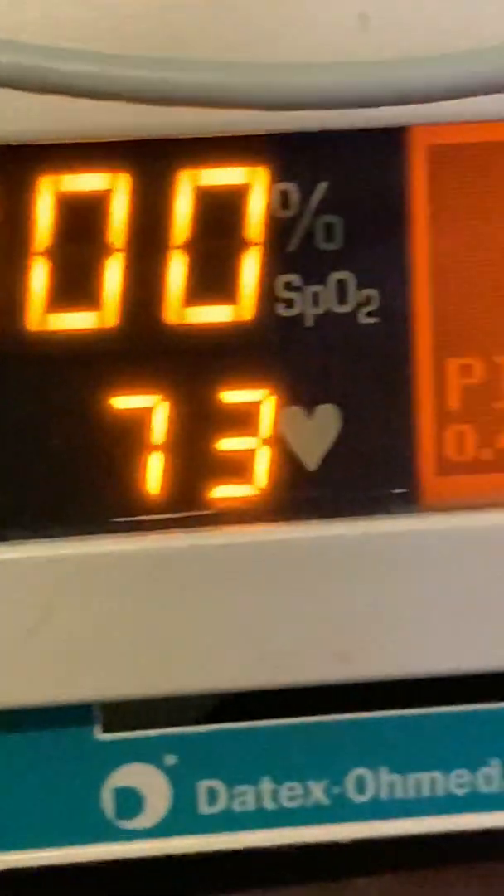Good evening. If you look at this, you'll notice that I have a really nice piece of equipment here. It is the Datex Omeda 3900P Pulse Oximeter.